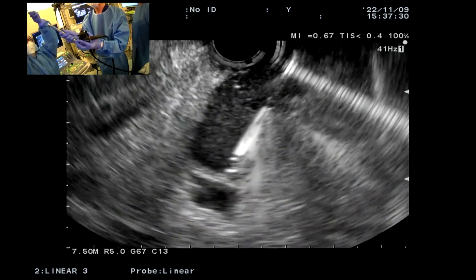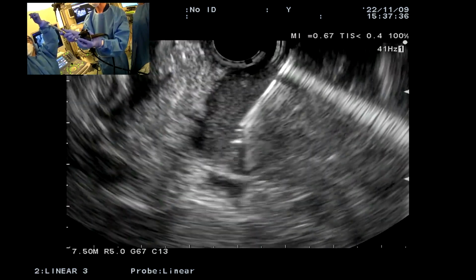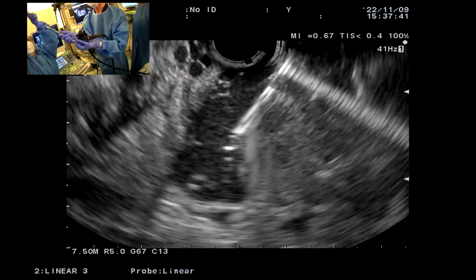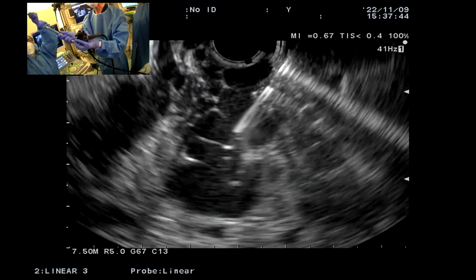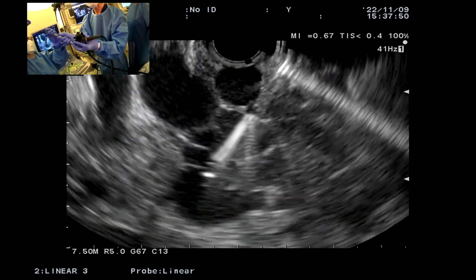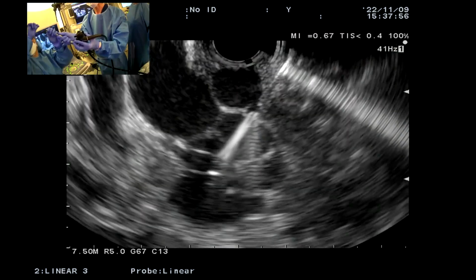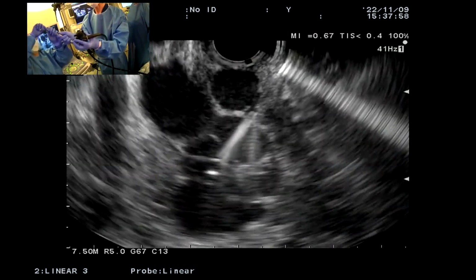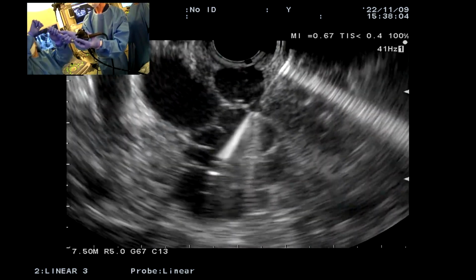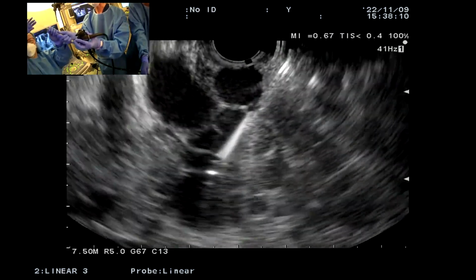And I'm going to pull back just a little bit because I want to keep this nice and free inside of the lumen of this big fundic varix. And often you'll get a little bit of bleeding into the varix too, so it starts to look a little bit more cloudy. Go ahead, please. Yes, please. We definitely have to put 2 coils, and maybe even a third one. So we'll see, though. We'll see. 220. Okay. So we're putting in our largest coils here. So you'll see it come out in just a moment. It's very echogenic. And what's important is that I don't get pushed out.